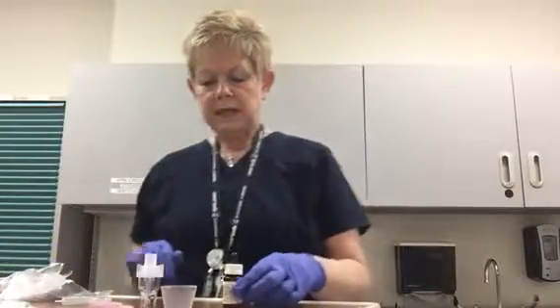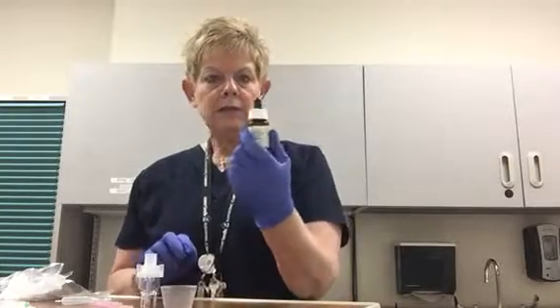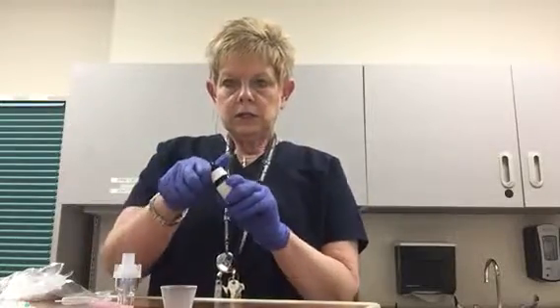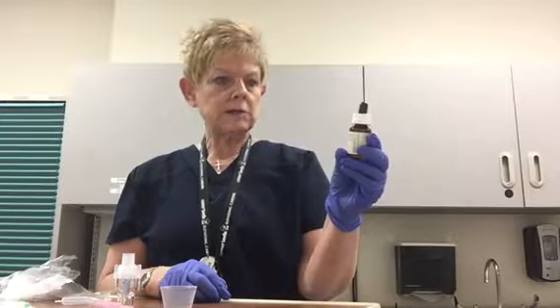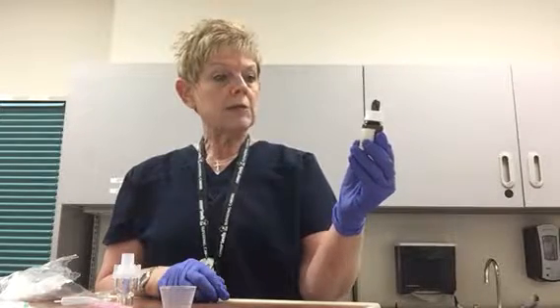I'm going to start with the multi-dose bottle with a dropper — very simple and easy to do. What you're going to do is read the label and make sure you have the right medication first. This is albuterol sulfate in a 0.5% solution concentration, and I read the label and see it's 5 milligrams per mL. The unit dose of albuterol is 2.5 milligrams, so that means we're going to be drawing up one half of a milliliter.